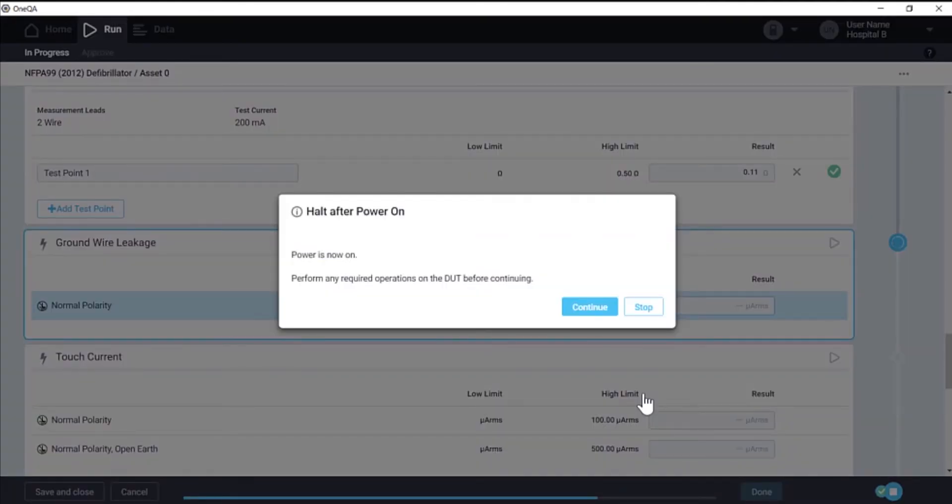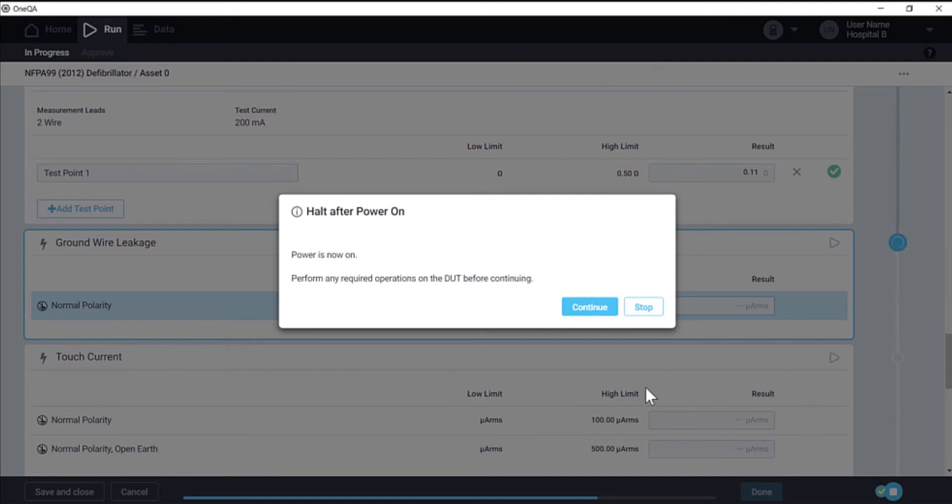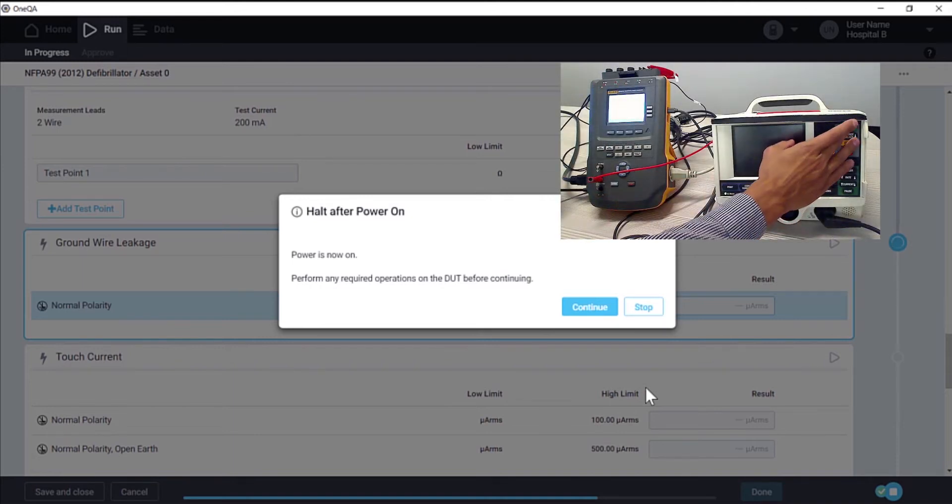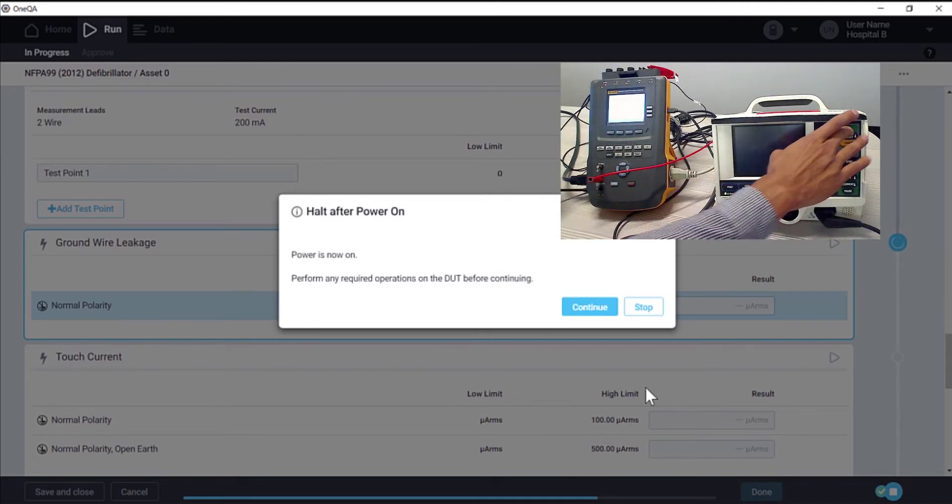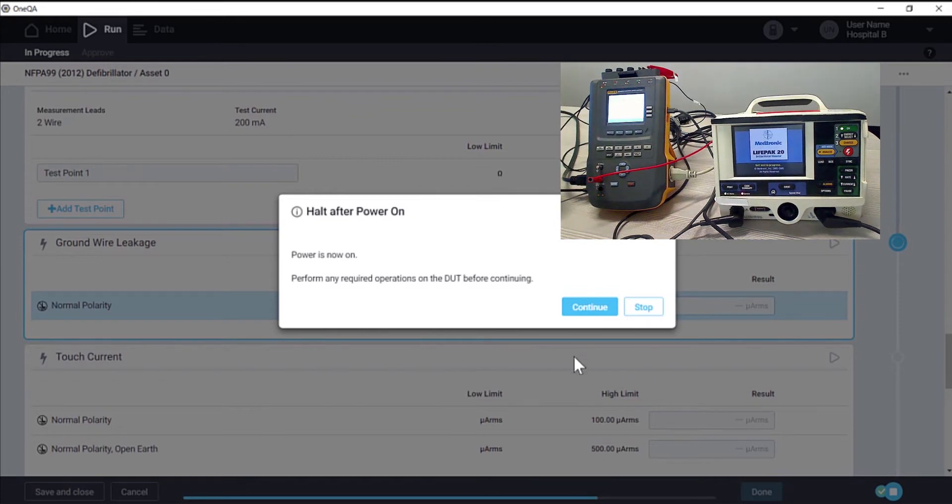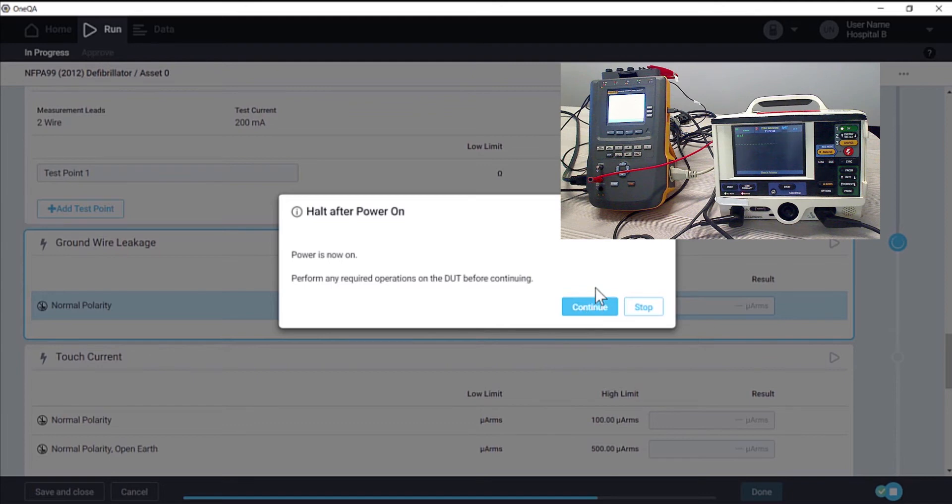In the case of this defibrillator, once power is applied, we can press the on button to boot it up completely. We'll want to do this before proceeding to the next test. Once it's on, we can click continue.